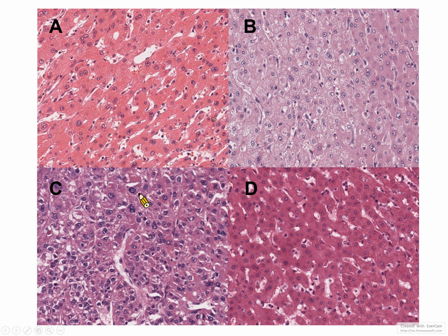Then the third rule is more diverse morphology. So it has different shapes of nuclei. The shape is not regular. And the fourth principle is that the arrangement of the nuclei is very irregular. So let me repeat these 4 principles: the bigger size of the nucleus, the darkness of the nucleus, the shape of the nucleus, and the arrangement of the nucleus.